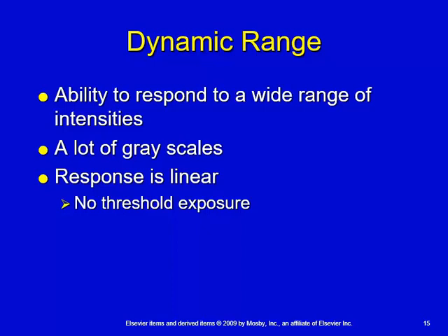the response on a digital imaging system, then what you see is that there's a 45-degree angle for the exposure on a digital system using a CCD, as opposed to there becomes almost a threshold exposure before you start to get into useful densities on screens and films.